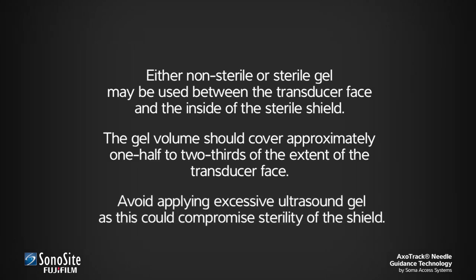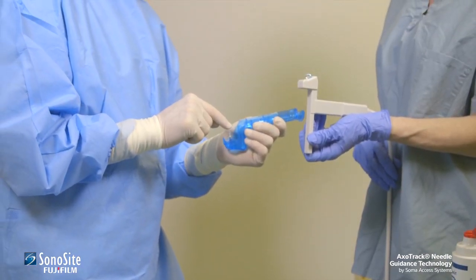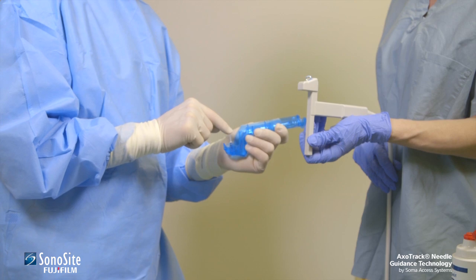Avoid applying excessive ultrasound gel, as this could compromise sterility of the shield. Visually confirm that the protective cap is properly positioned over the needle guide.